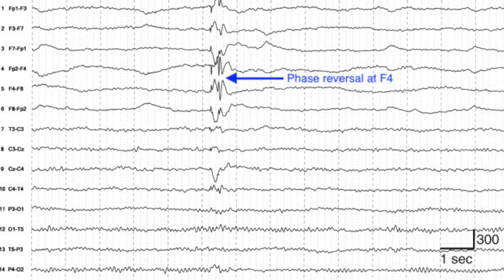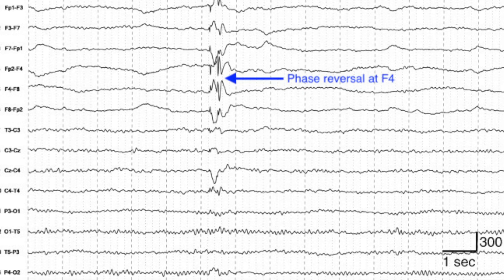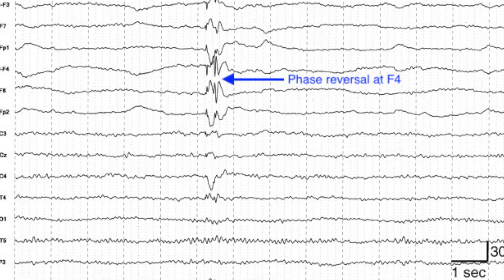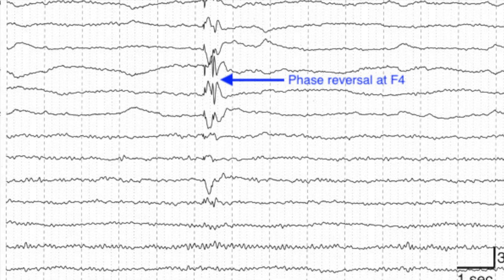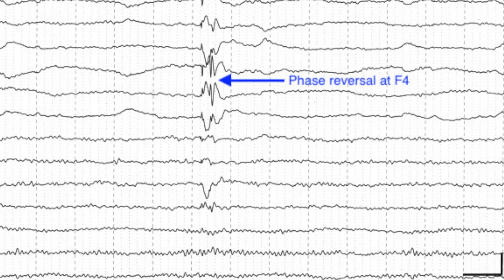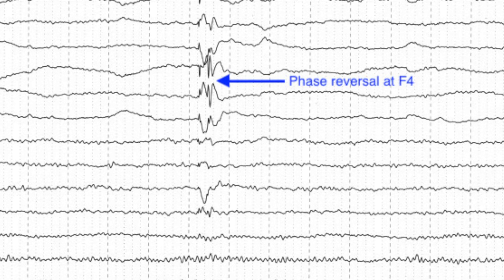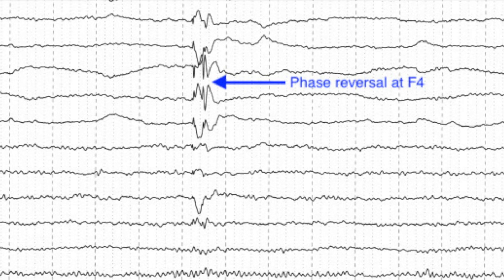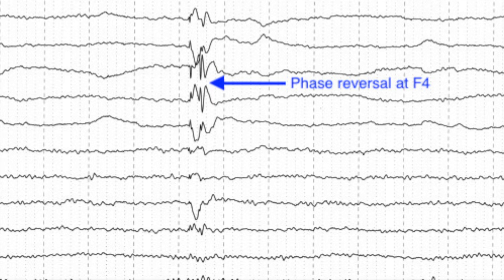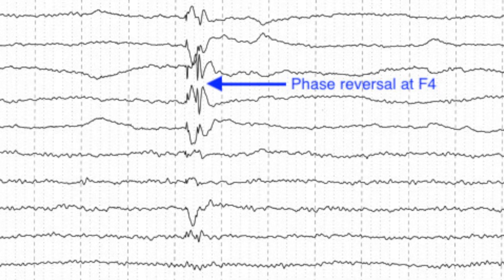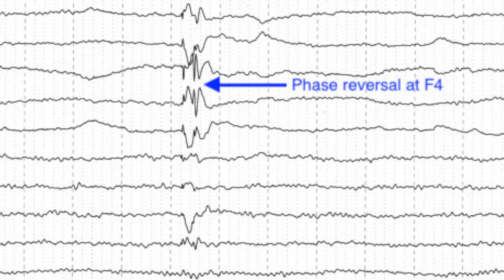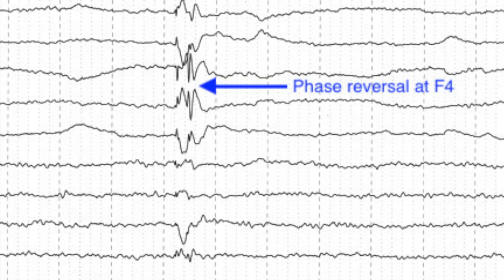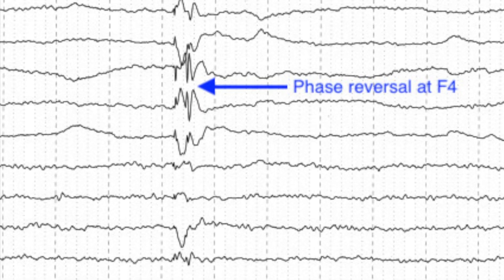For focal discharges, it is important to localize the lesion. In bipolar montages, phase reversal is the key for localizing the lesion. In confusing cases, it is always helpful to localize the lesion using average reference montages, where the lesion is located at the area with the highest amplitude.